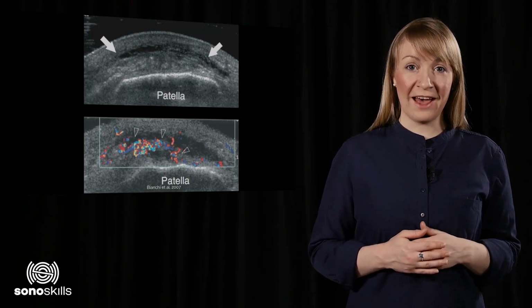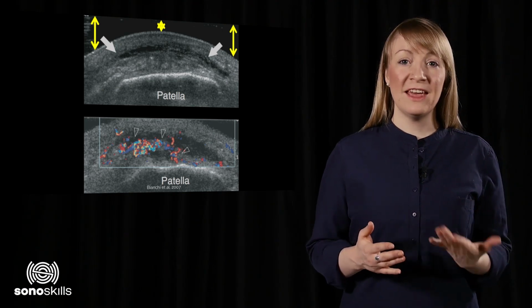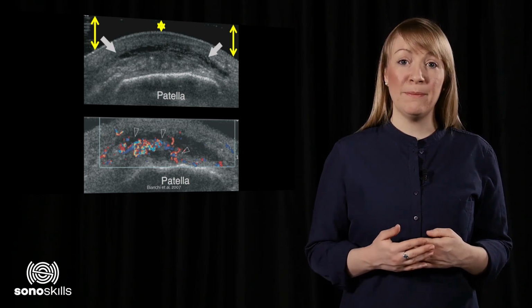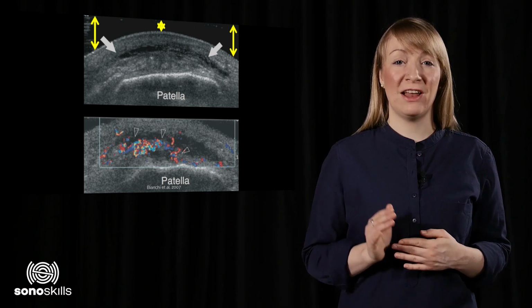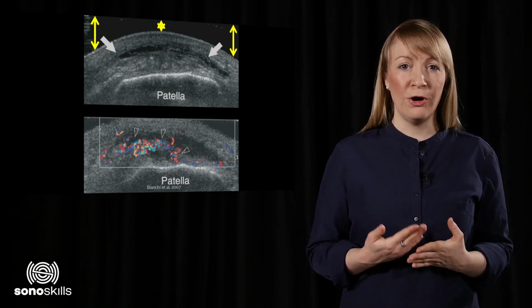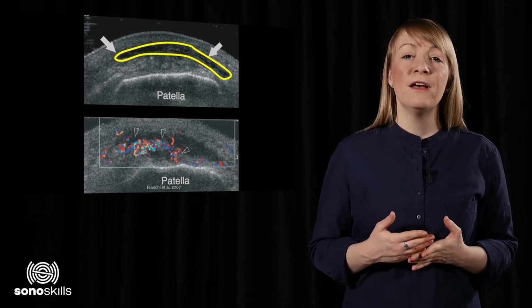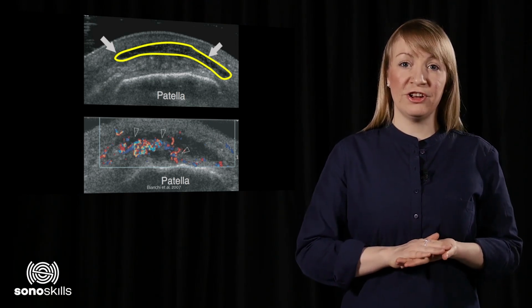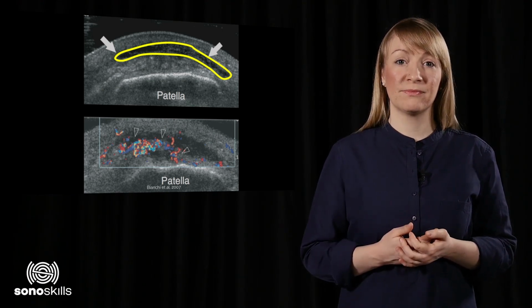This is a longitudinal scan of the patellar region. Please note the distance from the skin to the top of the image. This indicates that a bigger amount of gel has been placed on the patient's skin and that the transducer has been placed on that very lightly. All of this has been done to reduce the pressure on the pre-patellar region. Because of this, the pre-patellar bursa can be scanned. Too much transducer pressure would have squeezed the bursa, with a false negative as a result.